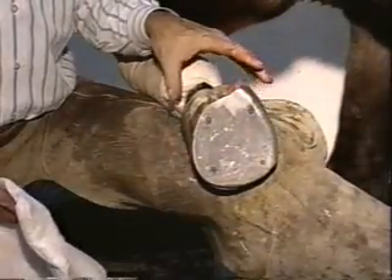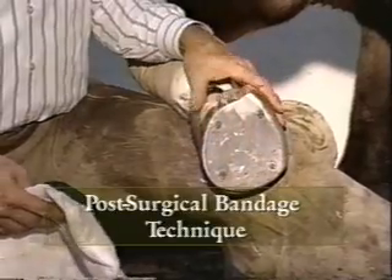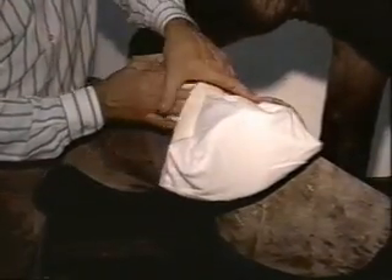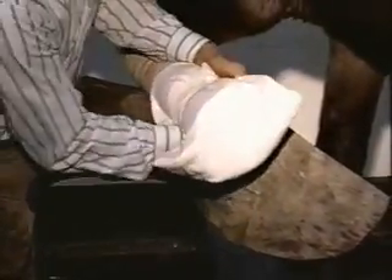I always apply a bandage over all my post-surgical feet, even though I've got the protection of the hospital plate, just to eliminate any debris that may soak through. I use a combine bandage — I cut it long enough to come up the back, go up the front, fold the ears in. The principle of this bandage is to secure the bandage at the pastern first.